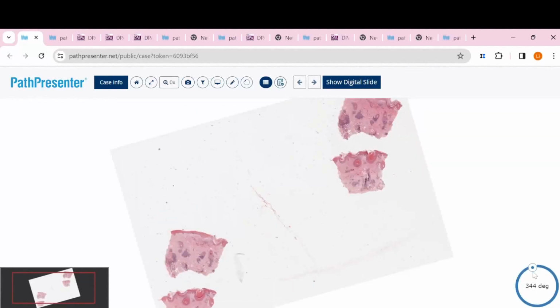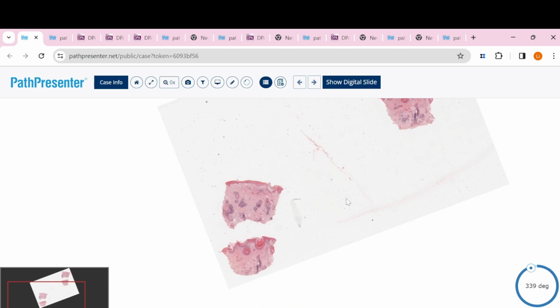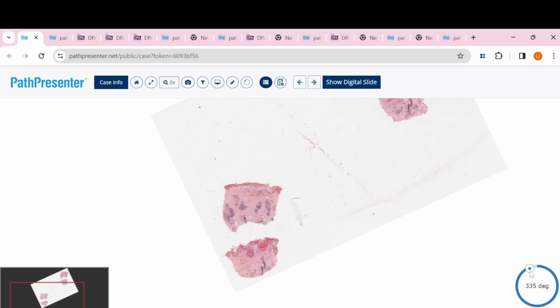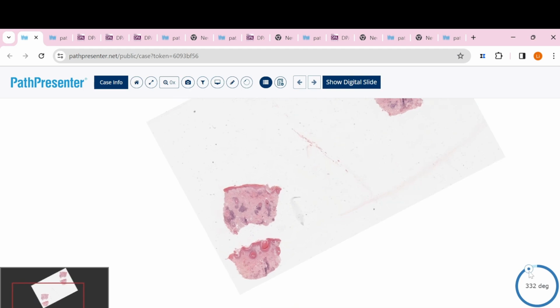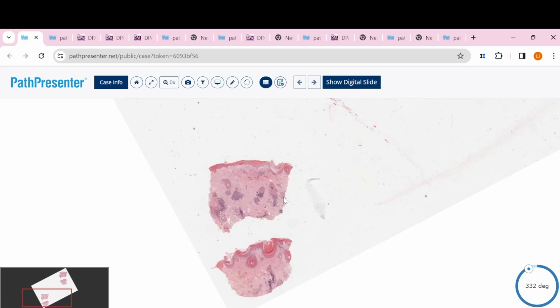One, the diagnosis is lupus. To make a diagnosis of lupus, I want you to first think of it in low power. This slide is really good because it seems it had every feature for lupus.